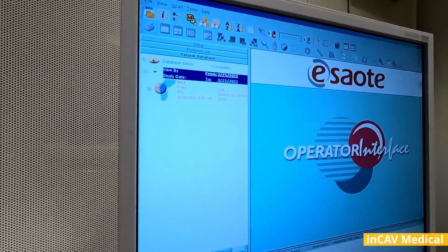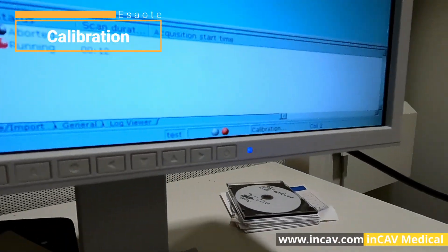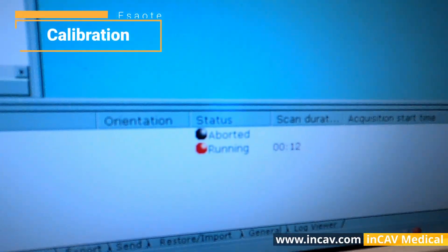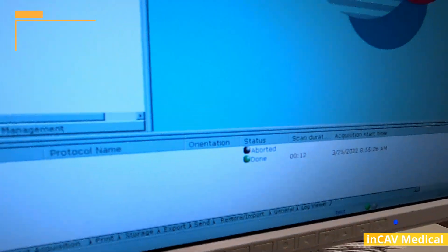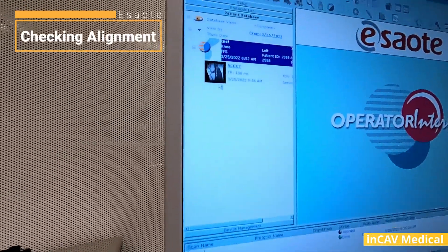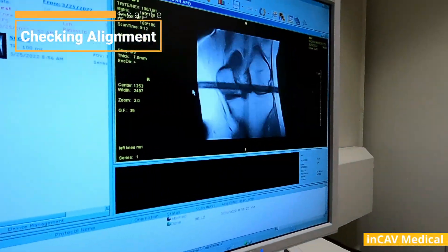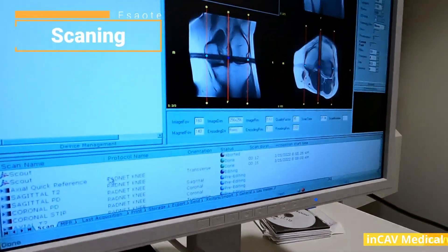The MRI will perform a calibration before starting the scan. It could be several minutes. The status LED will turn green when we finish the scan. Then it will show a thumbnail of the image on the patient database area. Click on the thumbnail to open the image and see the calibration, quality, etc.